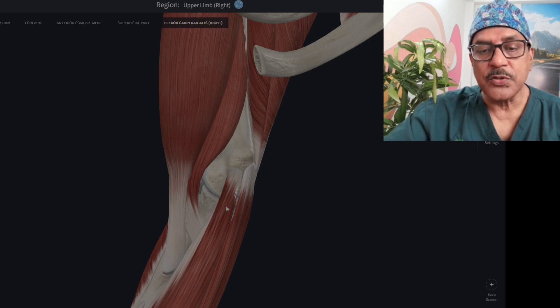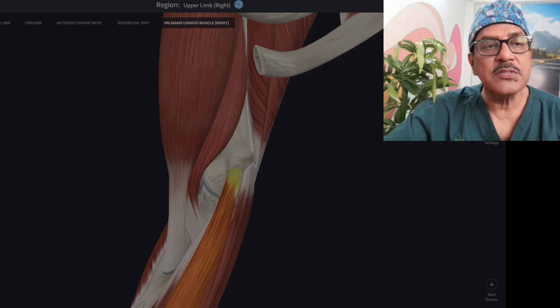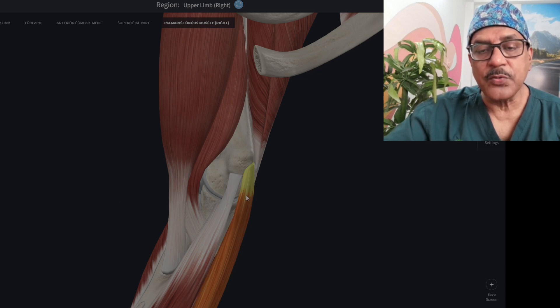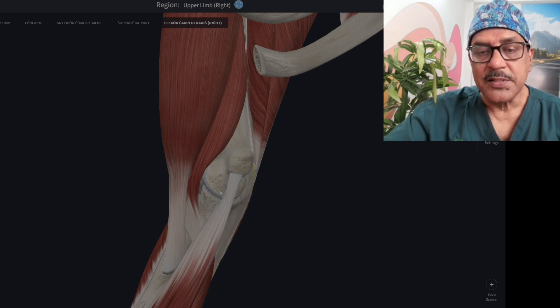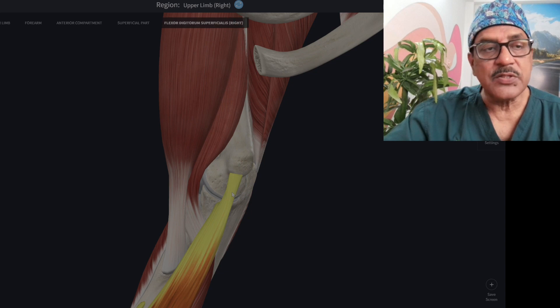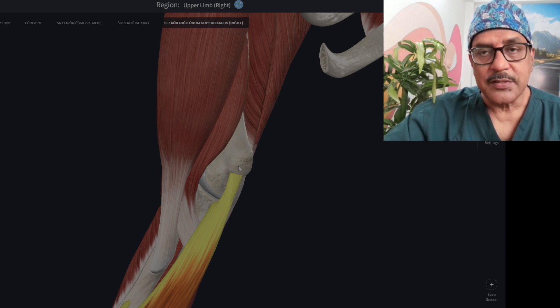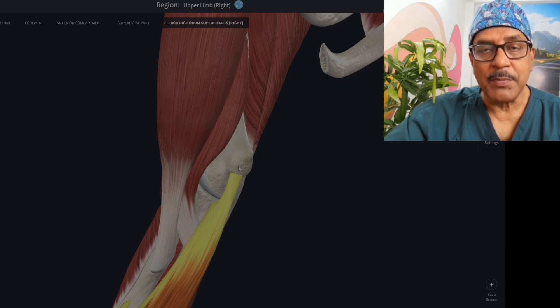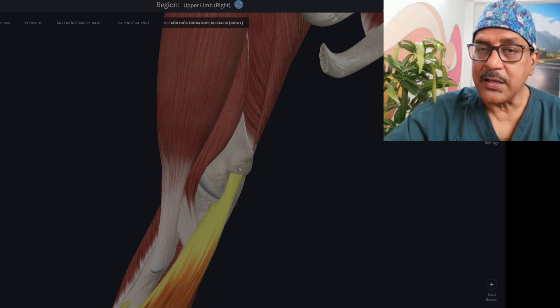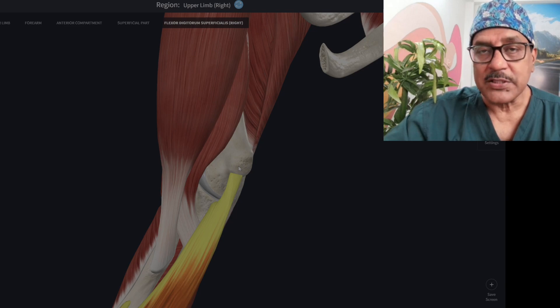Next comes your palmaris longus. After reviewing that, next comes your flexor carpi ulnaris. And after the first layer of muscle, the second layer is your flexor digitorum superficialis. So from lateral to medial, we have pronator teres, flexor carpi radialis, palmaris longus, flexor carpi ulnaris, and below that flexor digitorum superficialis — all part of the common flexor tendon.